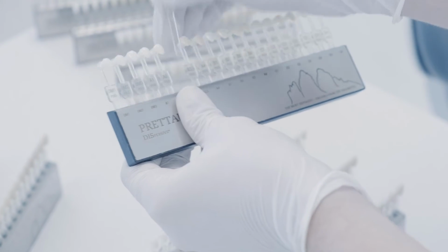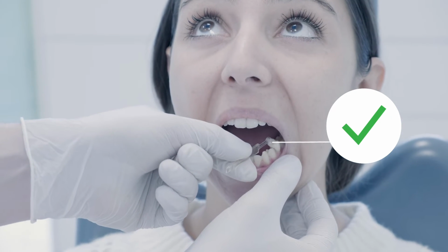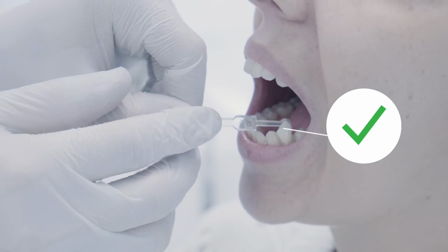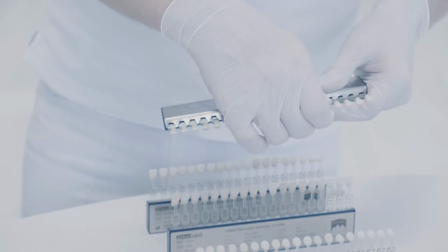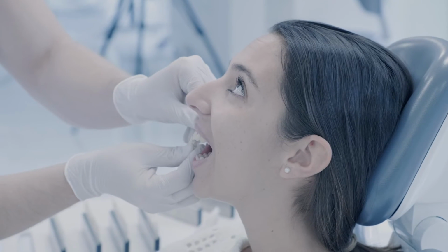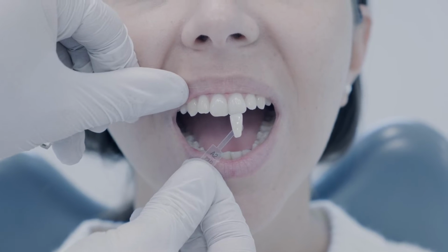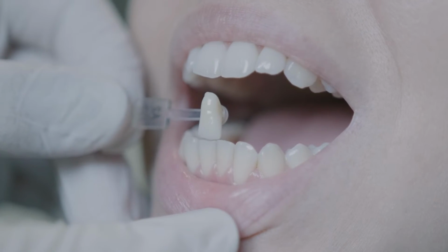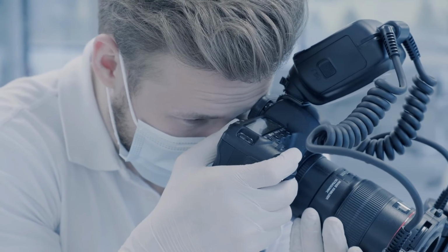Hold the shade guide in the shape of a premolar against the natural teeth to determine the natural tooth shade in the posterior region and the shade effect on the occlusal surfaces. Hold the shade guide in the shape of a lower incisor against the natural teeth to determine the natural tooth shade for a monolithic lower jaw structure to be fabricated in Prettau dispersive zirconia, or to check the interplay with the natural residual teeth or the interplay with an already fabricated zirconia upper jaw structure.